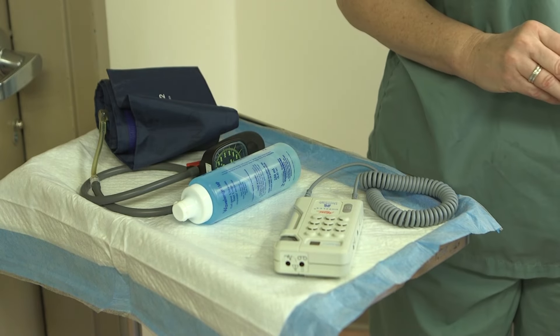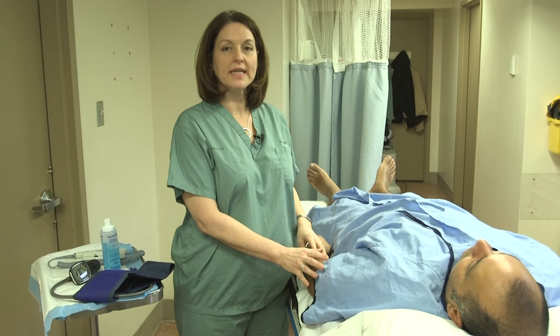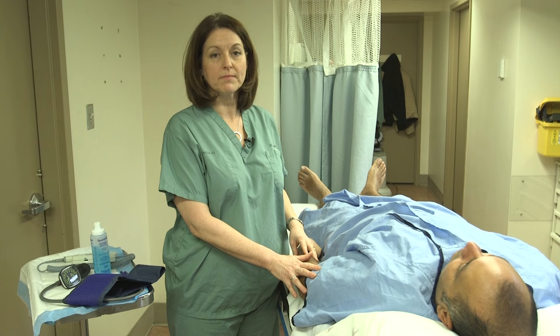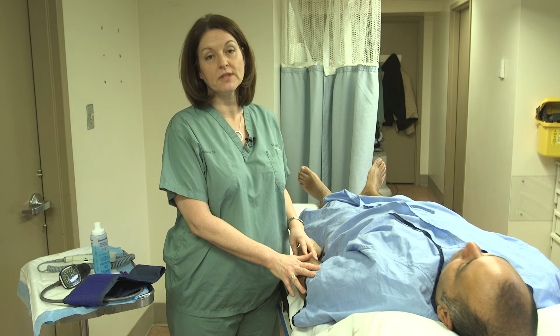The next thing is that you actually want to make sure that your patient is lying comfortably and relaxed for about 10 minutes to stabilize their blood pressure. It's also important to remind your patient not to speak while you're doing the test.